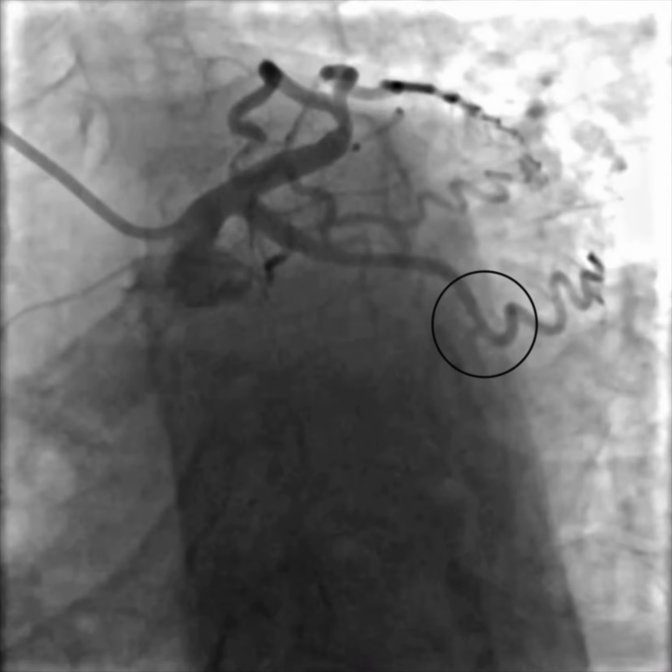If you train your eyes on the circumflex, you see that sure, it goes along and gives off an OM vessel and another OM vessel, but it does seem to terminate a little bit prematurely. You've got the whole inferolateral wall here that needs blood, and maybe that's coming from a big RCA. Maybe we haven't shot that yet, so we don't know if the RCA supplies blood here. But if not, you'd have to ask what's supplying blood here. And when you look extremely closely, you can actually see the beginning of a vessel there.